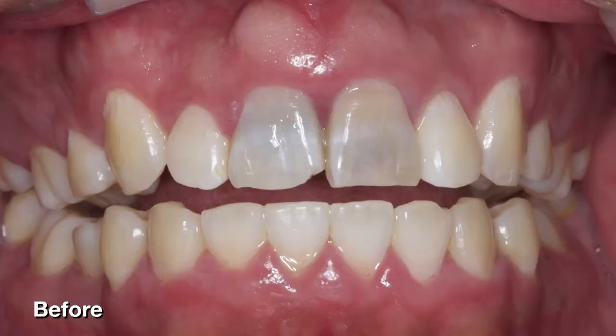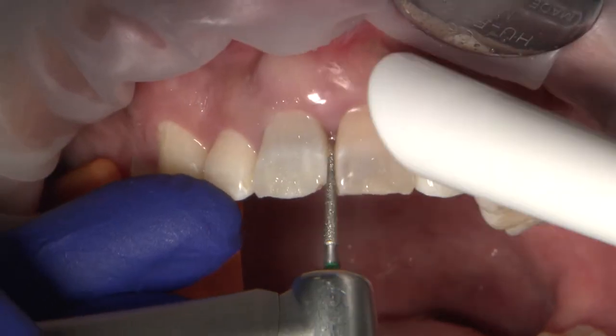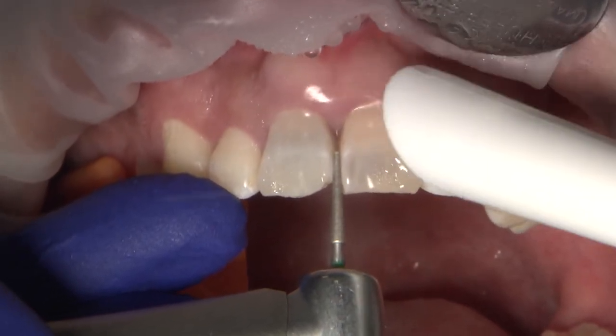The patient's primary goal was to restore his discolored teeth. The initial treatment plan included root canal treatment on 8 and 9, and CAD/CAM designed and milled Bruxer anterior crowns as final restorations. To start, only 8 and 9 were prepped.